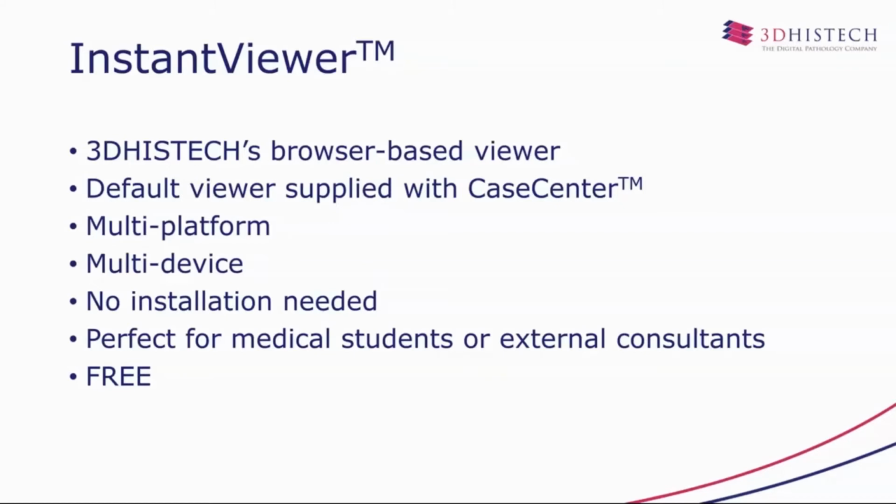Since there is no need for installation, it's the perfect solution for medical students or external consultants. Just imagine if you are a medical student preparing for your exams. Probably you don't want to spend the time installing software if you can open the slides instantly in your browser. The same applies to external consultants.